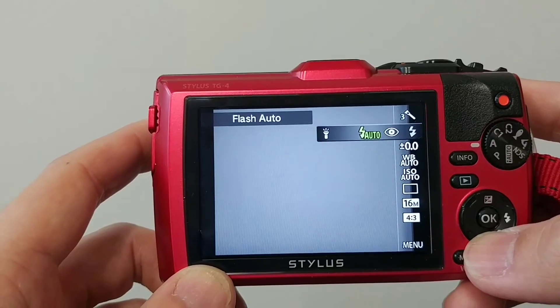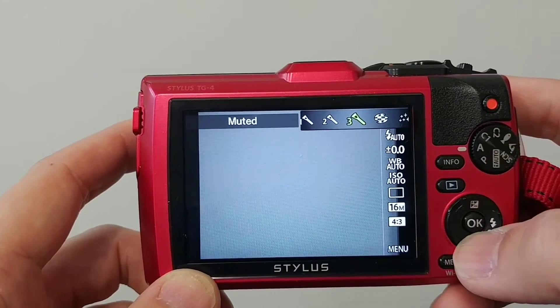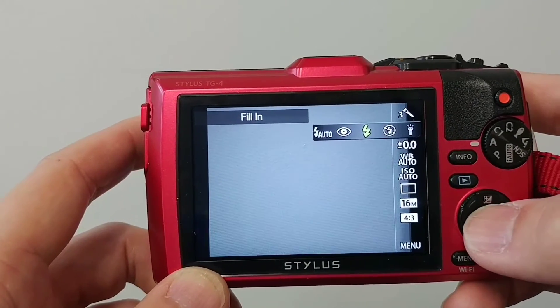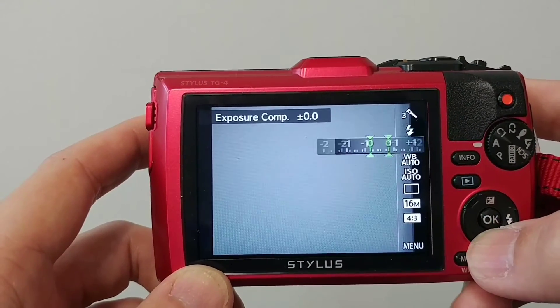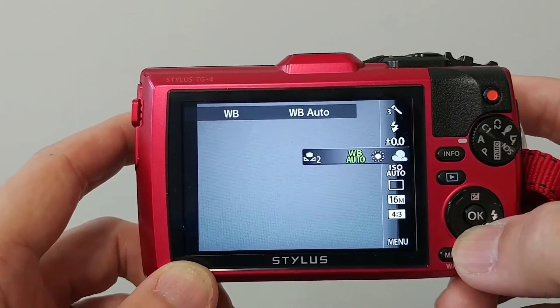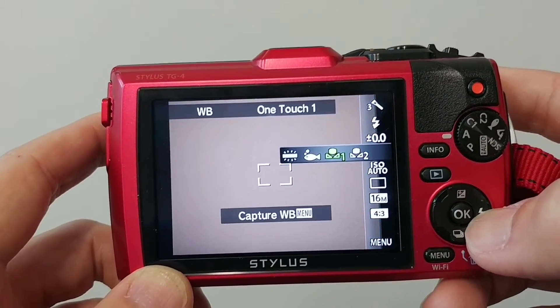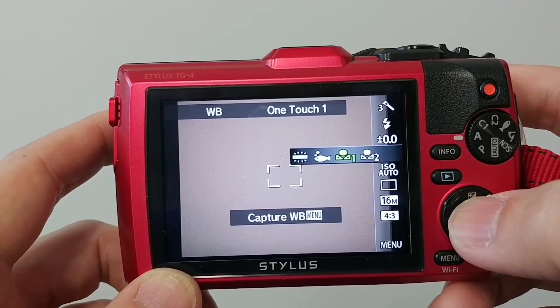I pick muted color — I actually prefer my dental pictures to have muted color. For flash, I set it to always on. Fill-in exposure compensation is not necessary.